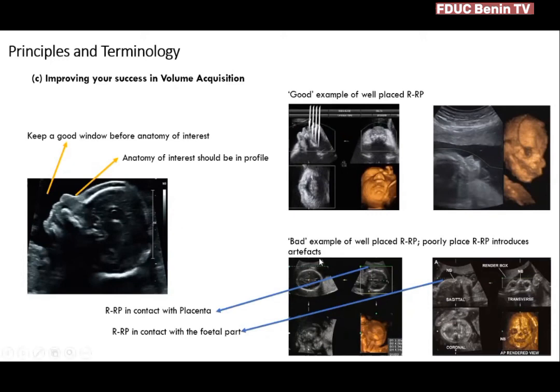And I give an example here. In this image, we found the reference reconstruction plane intersecting the fetal anatomy here.